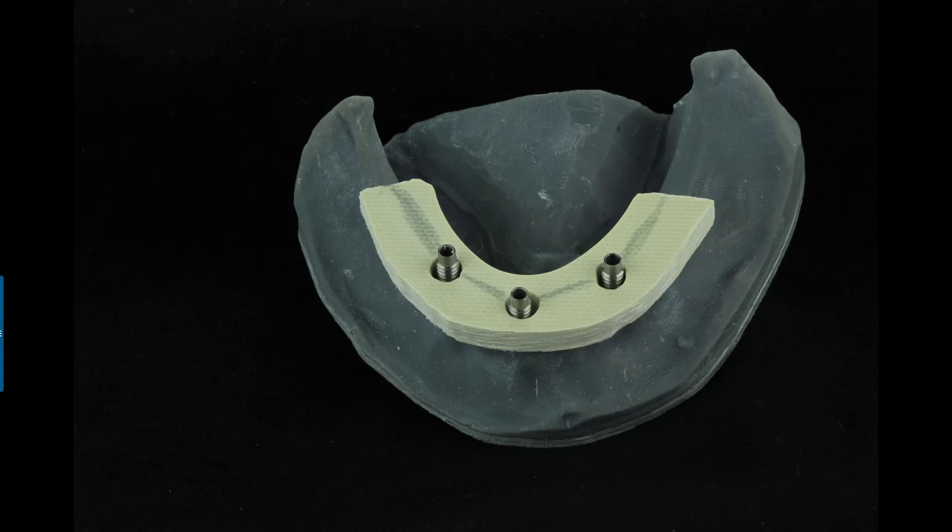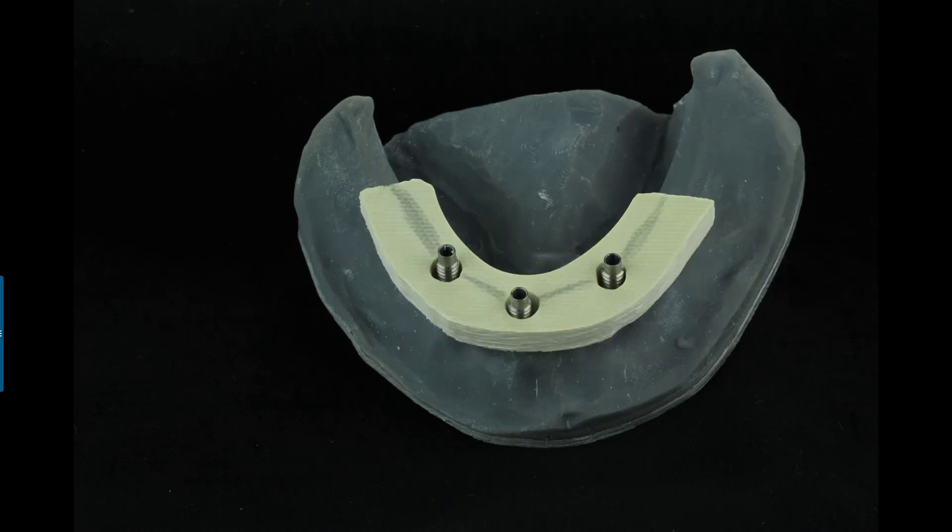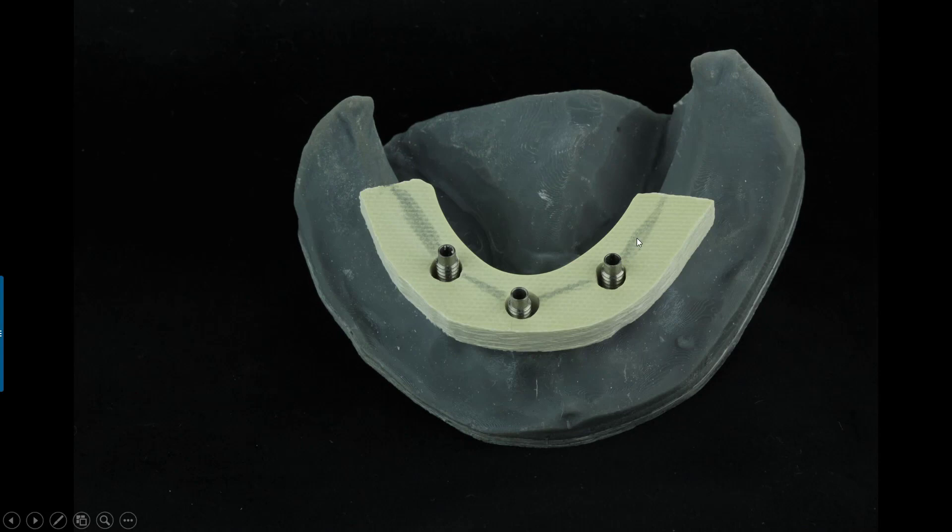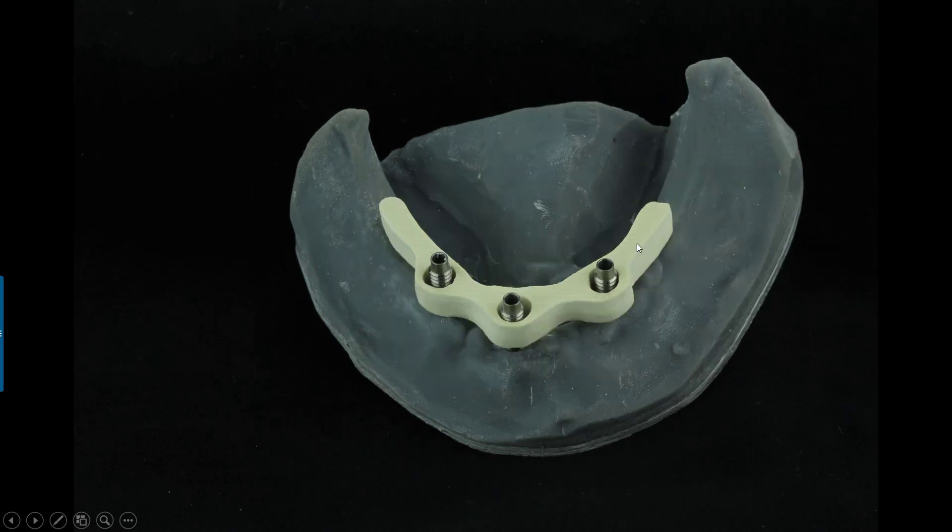If it's a fresh surgical site, obviously cover it with a piece of rubber dam. But you can see here, after I picked it up, I'm also going to just freehand in the shape with a pencil or a marker of the shape that I want to accomplish to conform it to the arch. So here it is trimmed down.